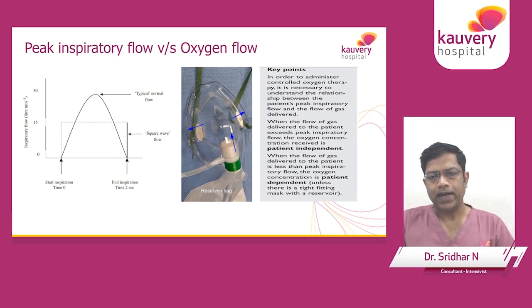Now when a patient takes a breath, the reservoir bag will empty and oxygen enters the patient's respiratory tract. When the patient breathes out, a valve closes at this point so that none of the air the patient is breathing out will enter the reservoir bag. The air goes out on both sides, where the blue arrows are showing, without mixing with the oxygen that's coming in. That's why it's called a non-rebreathing bag.